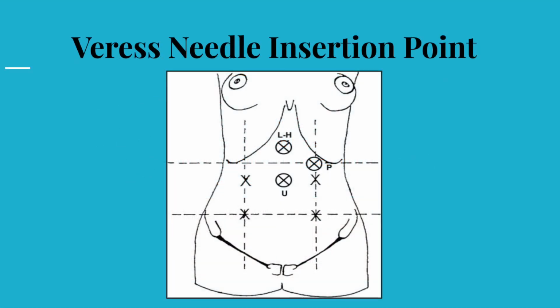The alternative of abdominal access to achieve pneumoperitoneum prior to port insertion via a closed method would then be using a Veress needle. It is a multi-component device consisting of a needle sheath assembly and a dilator cannula assembly.